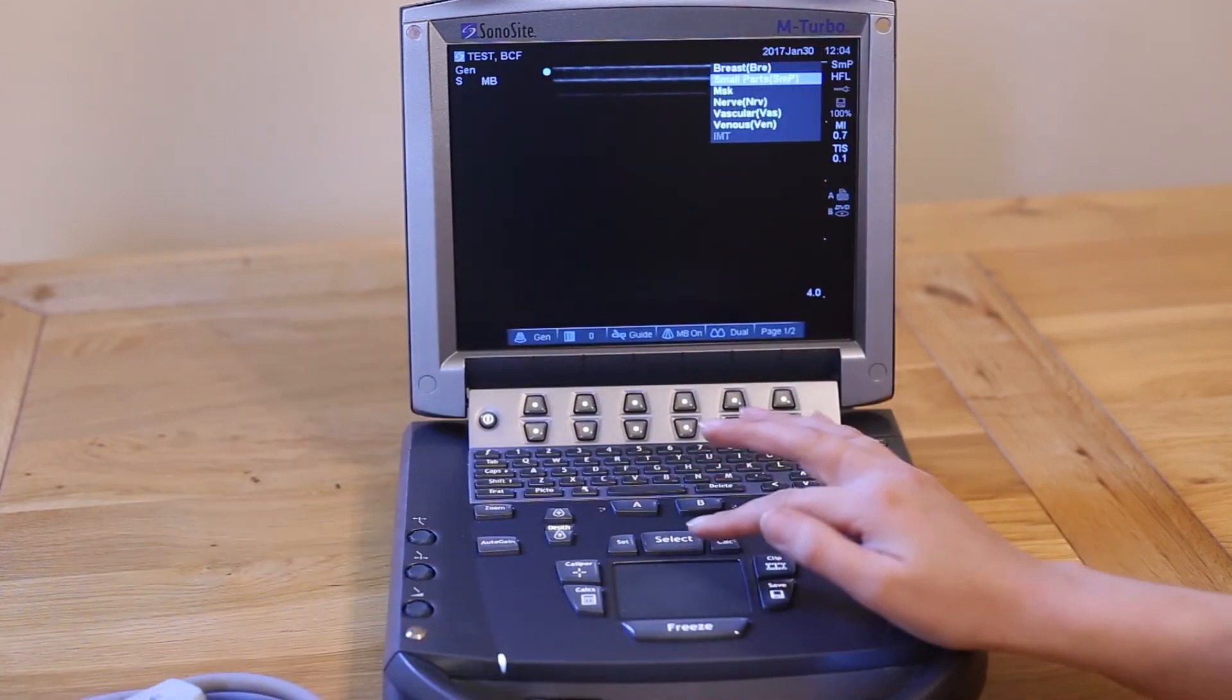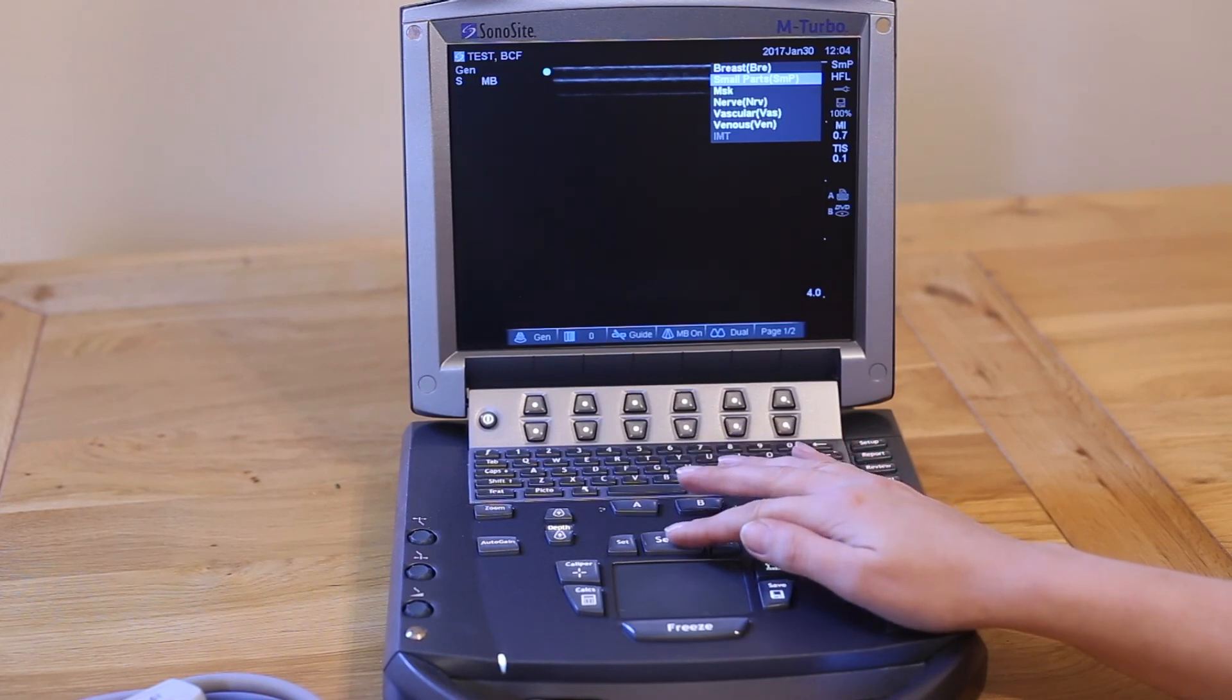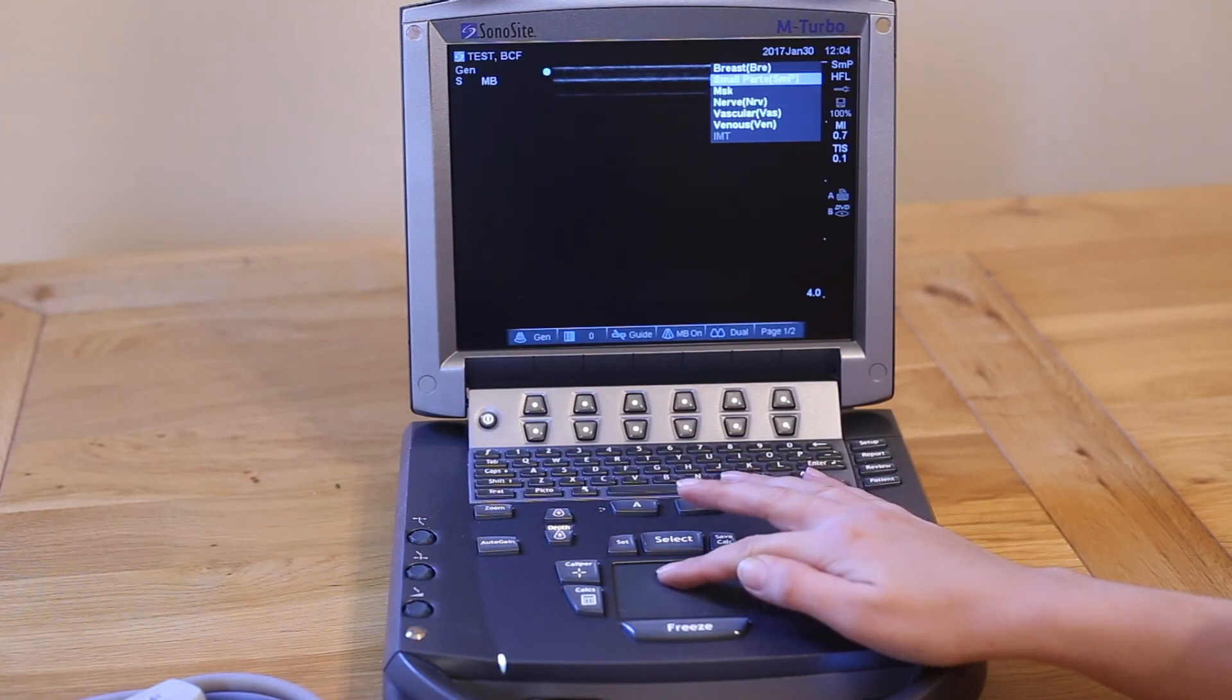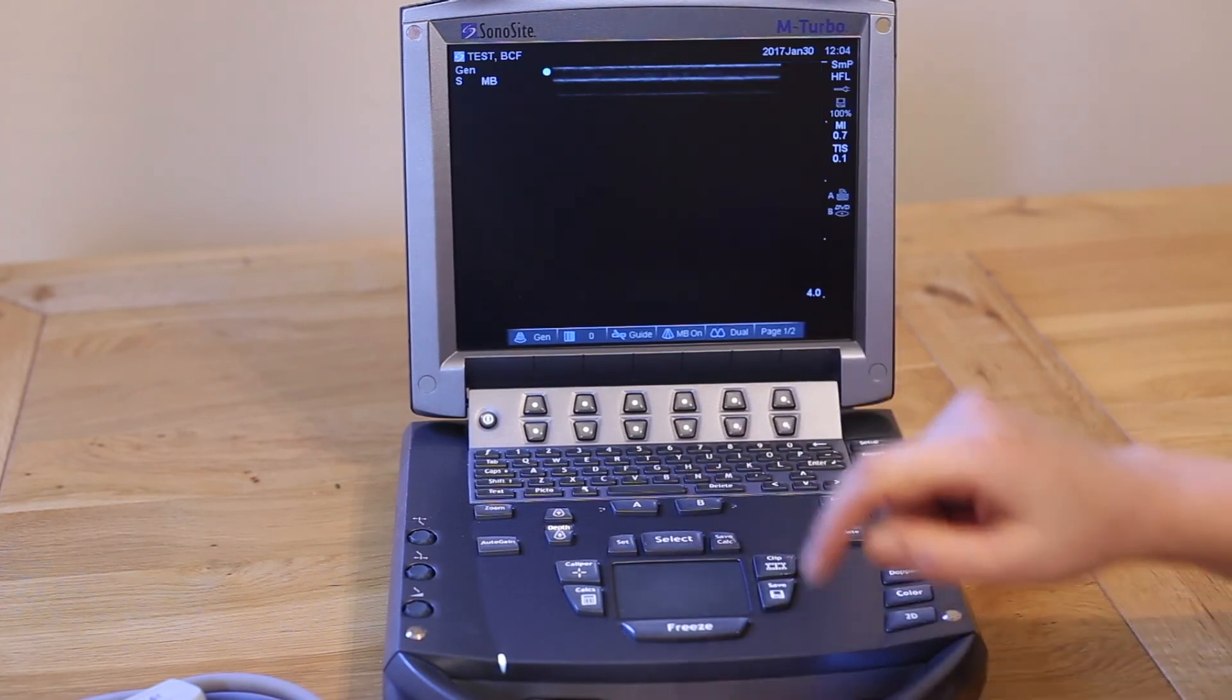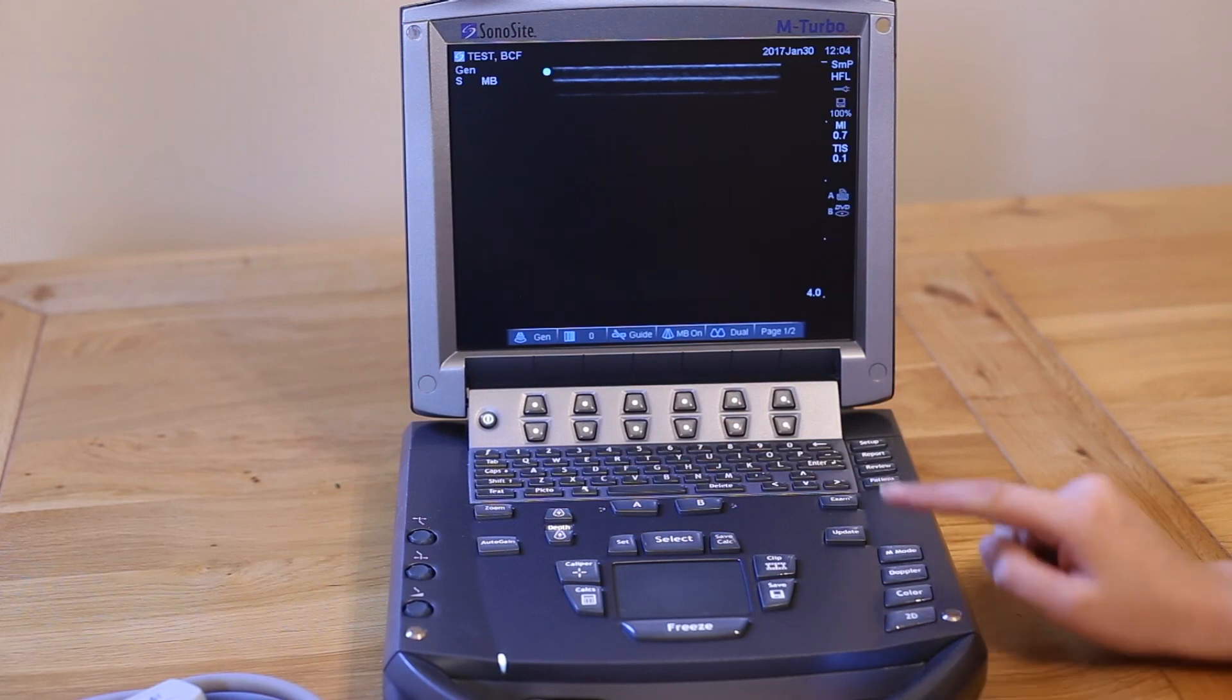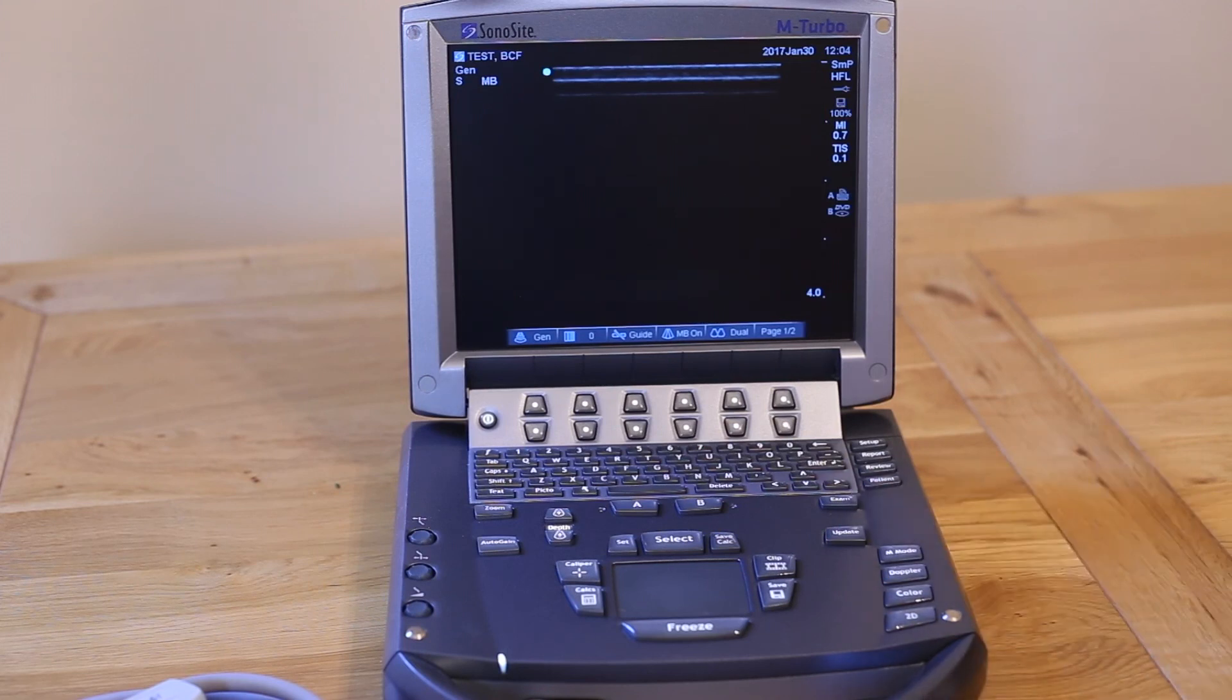Use the trackpad and select key to choose your preset. You can change your preset at any time during a scan. For example, if you start off doing an abdominal scan but then find you need to image the heart, simply press the exam key and switch to cardiac setting.